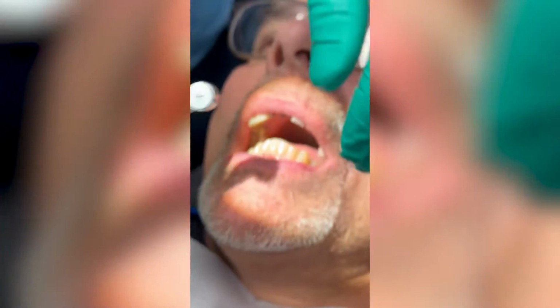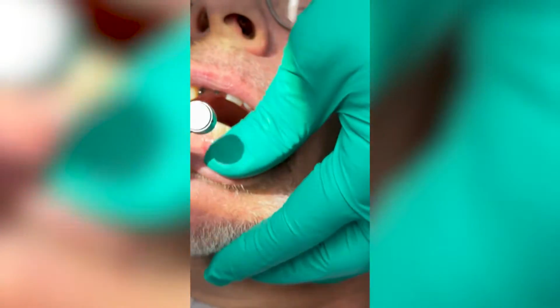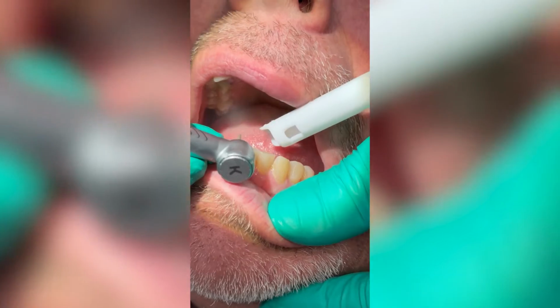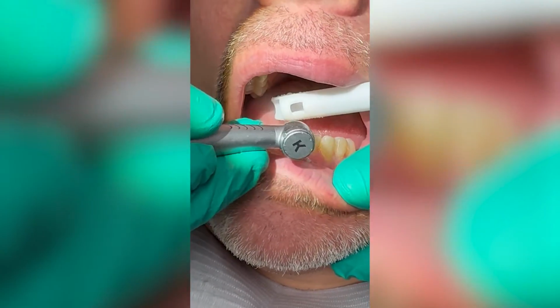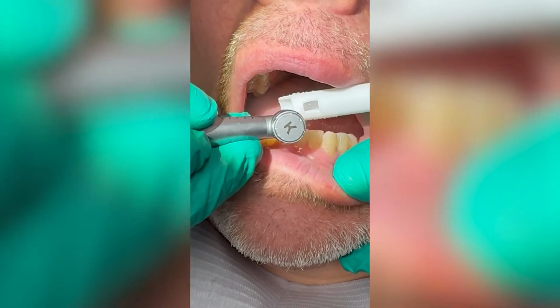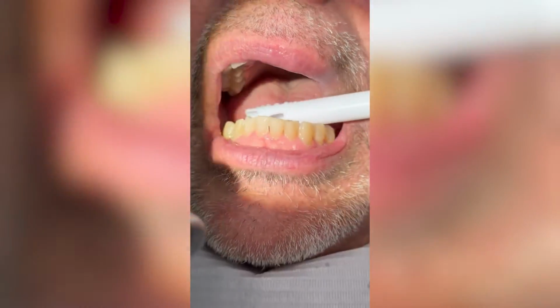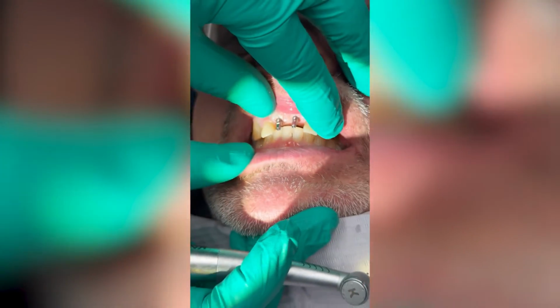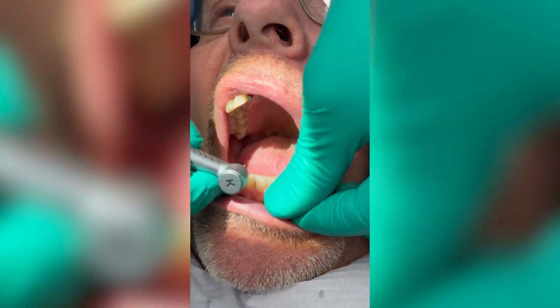So we'll just do a little bit of adjustment of the lower teeth, and we'll even them up a little. Bite together. Open, just to make a little bit of room for the occlusion. Close a little. Close. Close all the way. Okay, we got enough on number 9. But then we're going to do a little bit on number 8.